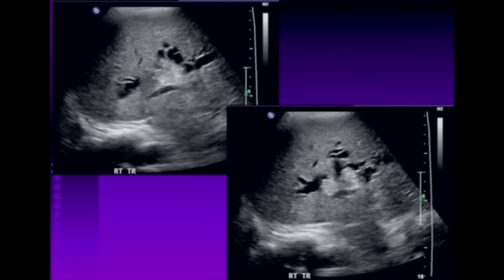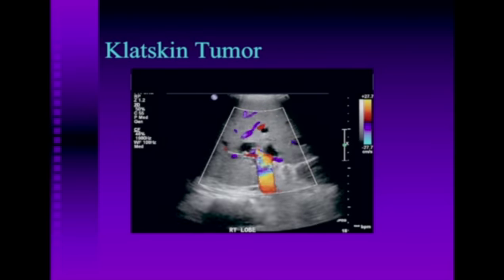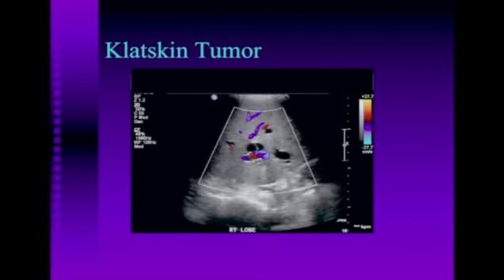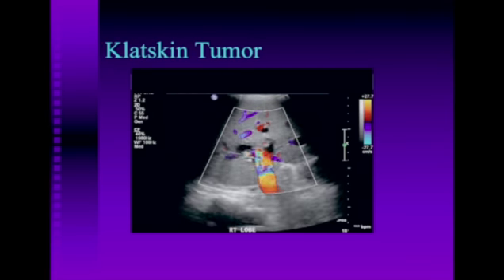Now, this is a little more worrisome. This is a focal mass in the junction region of the biliary radicals. It's mildly echogenic, and it has biliary obstruction of both sides associated with this. And this one on the video shows how this tumor is protruding into those ducts. And this is a typical central cholangiocarcinoma, otherwise known as a Klatskin tumor.